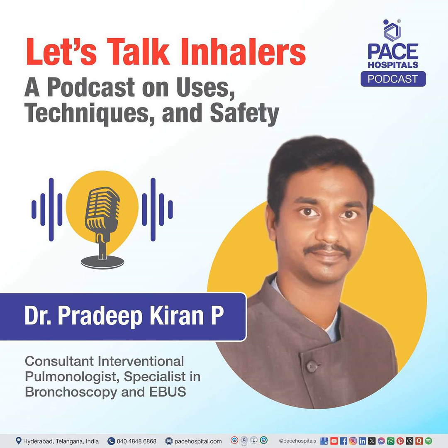So there are many other modifications also, like Symbicort, everything is there. Almost the principle is the same. When you remove the lid, it will open. Take a deep breath, the dose is delivered, and then it closes. So the most important thing is how effectively you inhale. The more effective your inhalation is, the more effective the drug delivery will be.